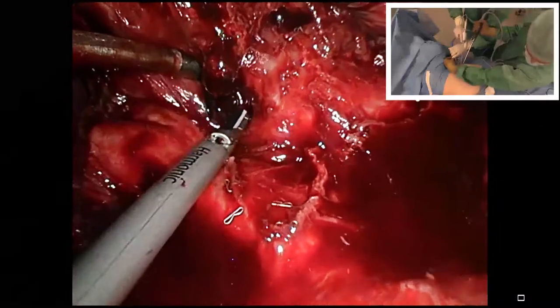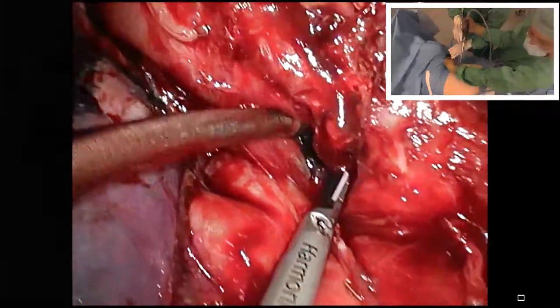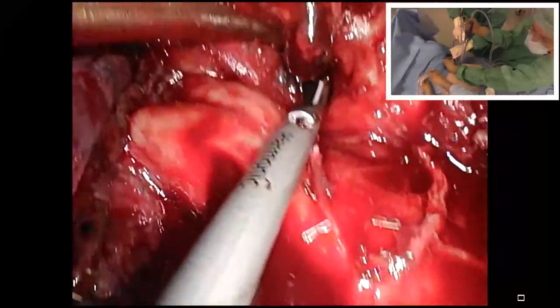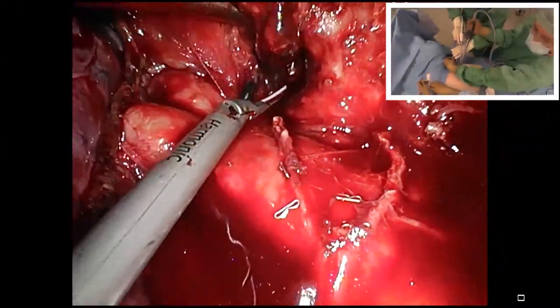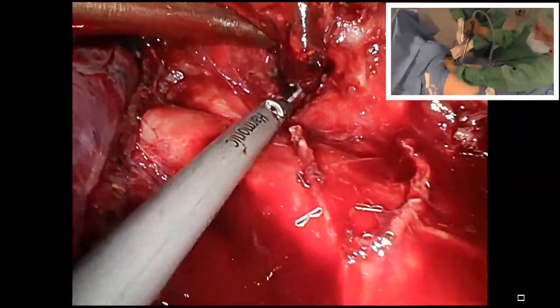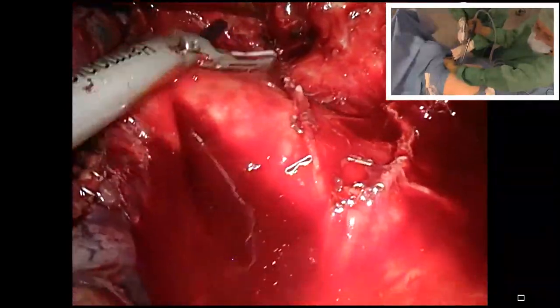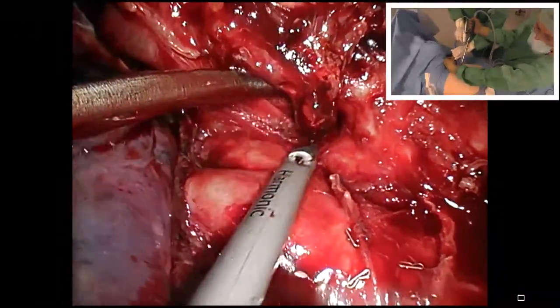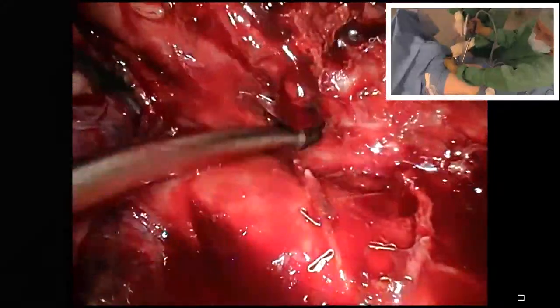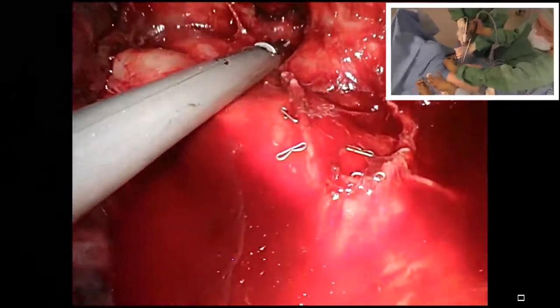Again, it would be recommended to do a little bit more, maybe. Well, Josh wants you to do a little bit more from the posterior aspect, sometimes, to better guarantee the last step of the fissure dissection. I think it's also clear here.